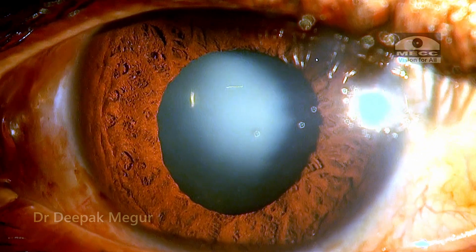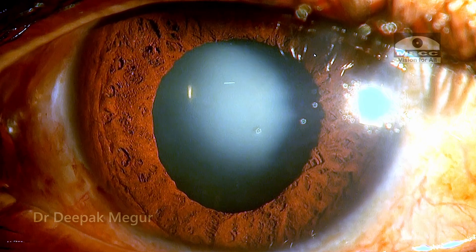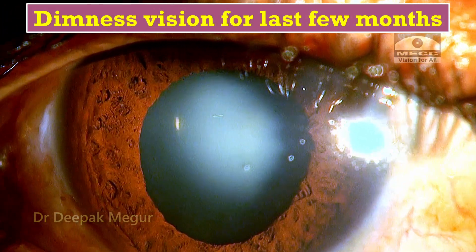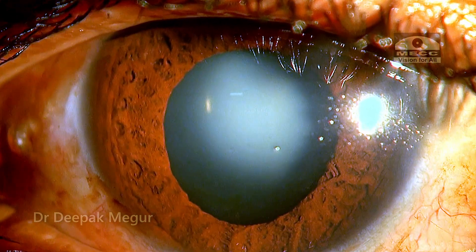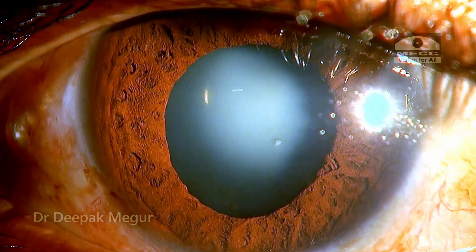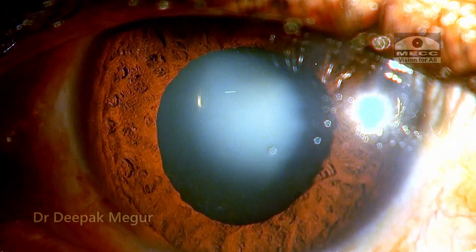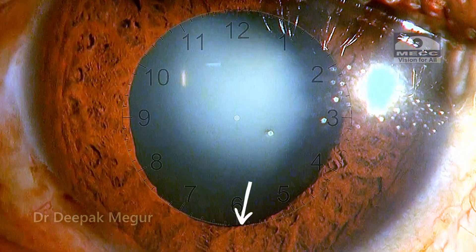I am Dr. Deepak Meghur, and today's case is about a 48-year-old gentleman who has presented to the clinic with history of diminished vision for the last few months. Past history reveals that he had sustained a blunt trauma many years back, evident in the form of small sphincter tears, very mild phacodonesis, and in the inferior quadrant I am suspecting about two clock hours of zonular dehiscence.